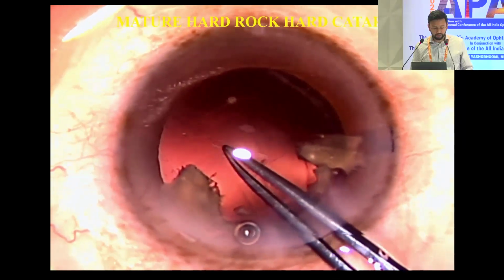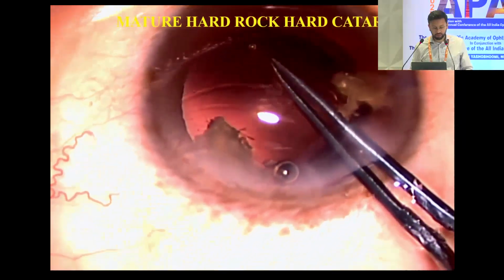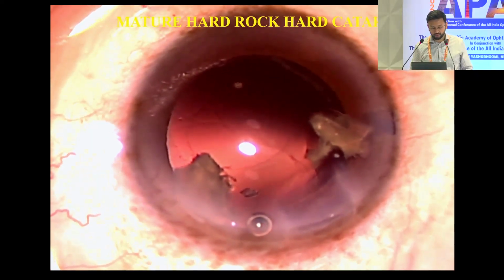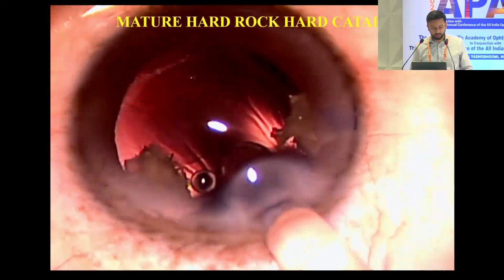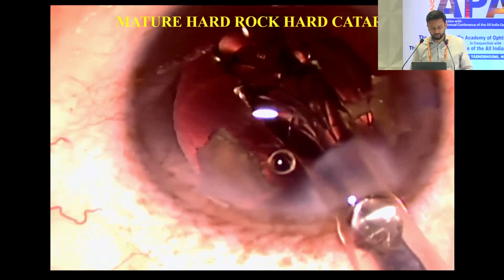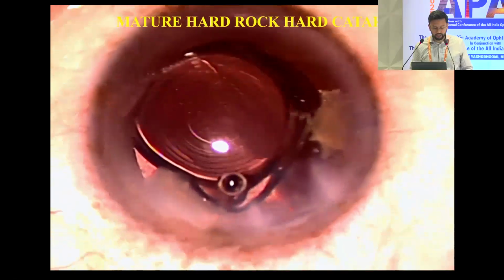Here we are attempting a posterior capsulorhexis to regularize the margins of the tear so that the tear does not extend towards the equator, and by completing the rhexis, the implantation of the IOL becomes even easier, because here we could complete the posterior rhexis. We are going forward with the plan of implanting the multifocal IOL. In this case, we carefully implant the IOL in the bag.